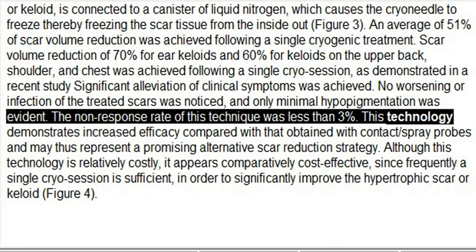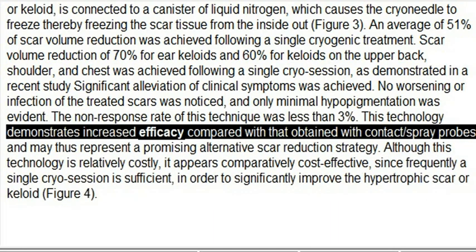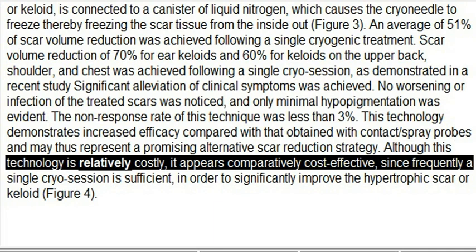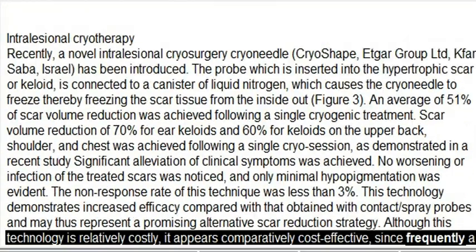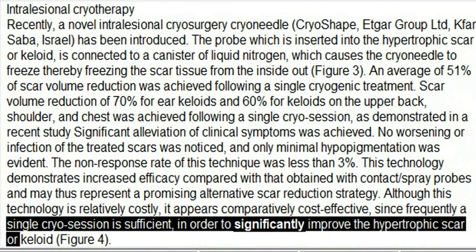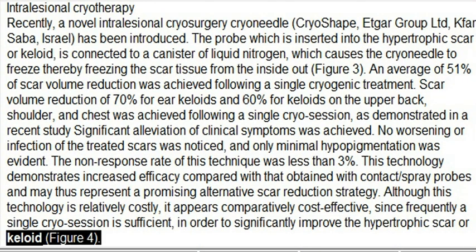This technology demonstrates increased efficacy compared with that obtained with contact/spray probes and may thus represent a promising alternative scar reduction strategy. Although this technology is relatively costly, it appears comparatively cost-effective, since frequently a single cryo session is sufficient in order to significantly improve the hypertrophic scar or keloid. Figure 4.